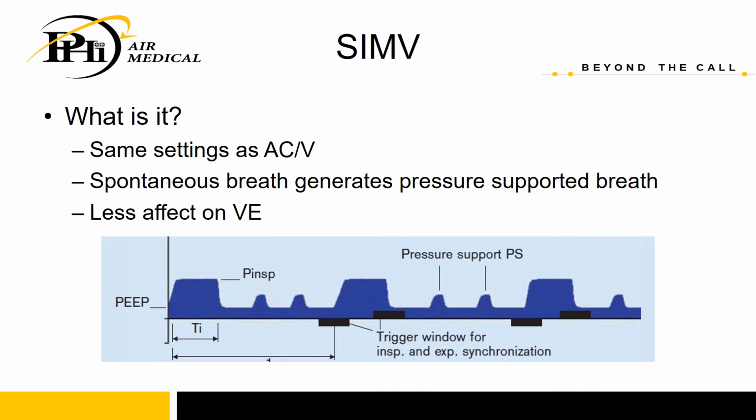So we can see that the volume is a lot smaller, it's a much shorter breath. It just tends to make the patient more comfortable if they are trying to generate a little bit extra minute volume, without really affecting our minute volume to the point where we may have to give them smaller or less support or smaller breaths in order to not breathe off all of their CO2. So this is just a really nice and comfortable mode of ventilation for a lot of our patients that are trying to take a little bit extra every minute.